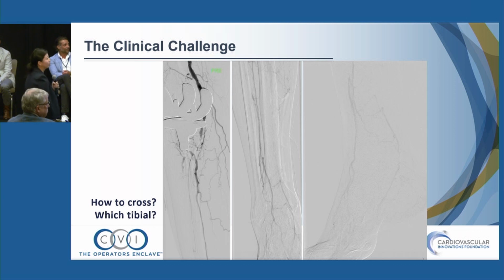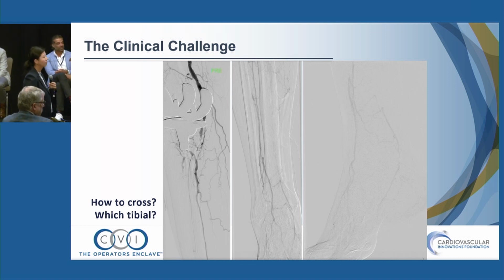I mean, if they have a popliteal pulse, I'll stick them. I flip them on the table, stick them antegrade. I just make sure my pressure looks like the systemic pressure, and I don't worry about inflow. I use the micropuncture. I do my diagnostic with the micropuncture, and then I kind of know what I'm putting in.